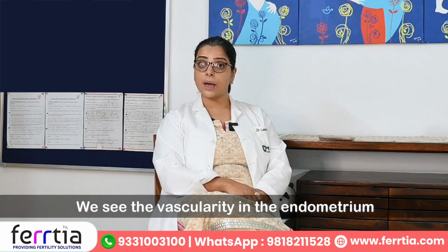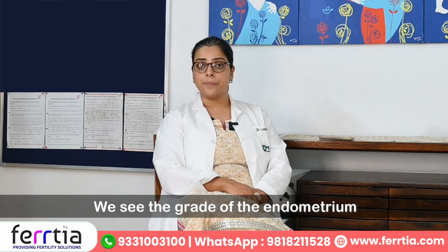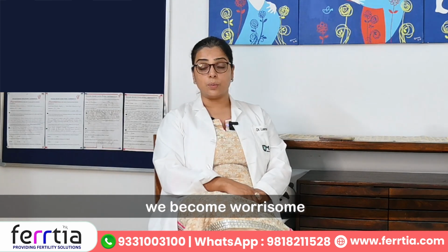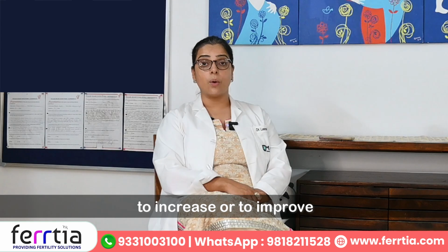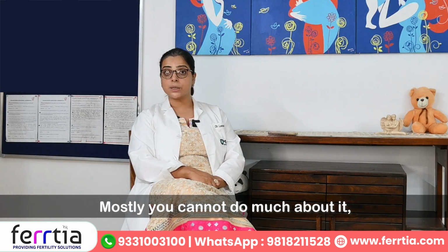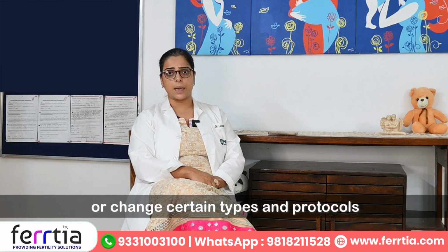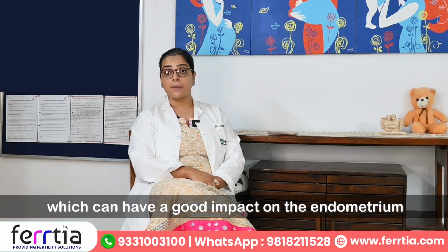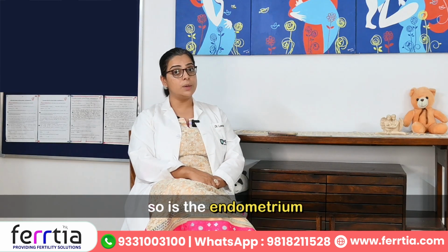We see the vascularity in the endometrium, which should be going to the deeper layers of the endometrium. We see the grade of the endometrium. If the grade of the endometrium is not good, we become worried and we add some medications to improve the grading of the endometrium. Mostly you cannot do much about it, but yes, you can medicate or change certain types and protocols which can have a good impact on the endometrium. The way a follicle is important, an egg is important, so is the endometrium.